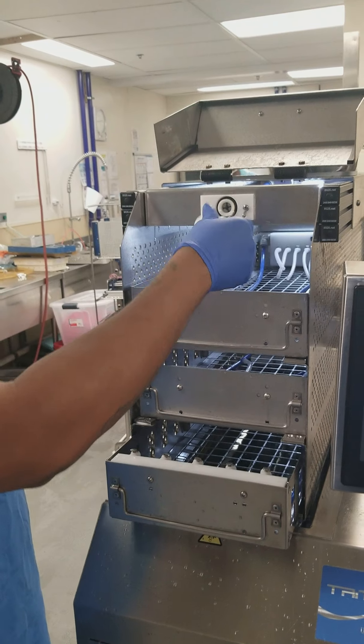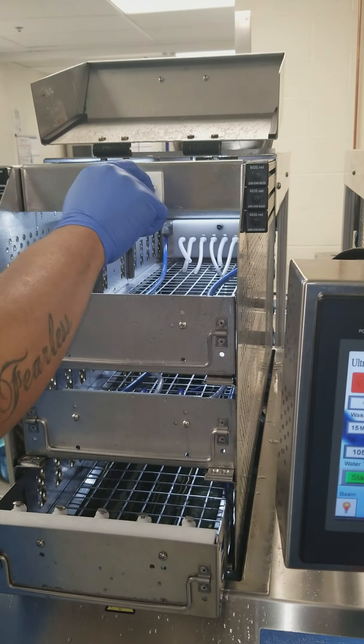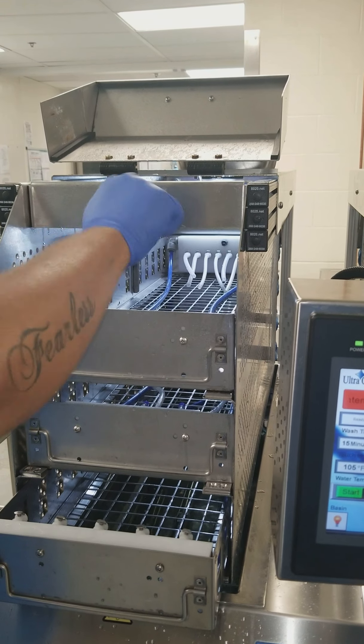This should be done at the start of your shift. And this just twists right back on, screws right back on like so.